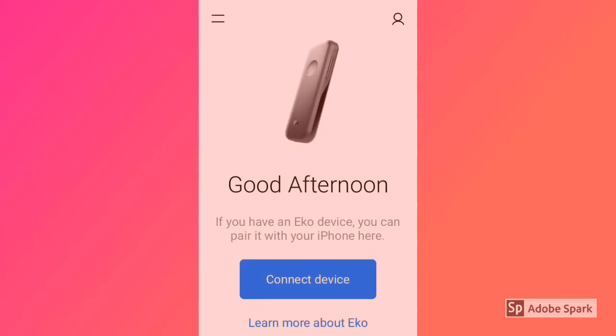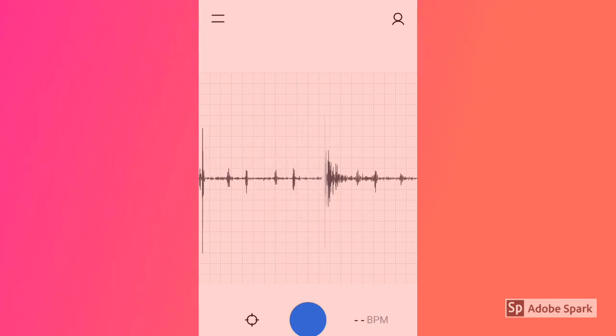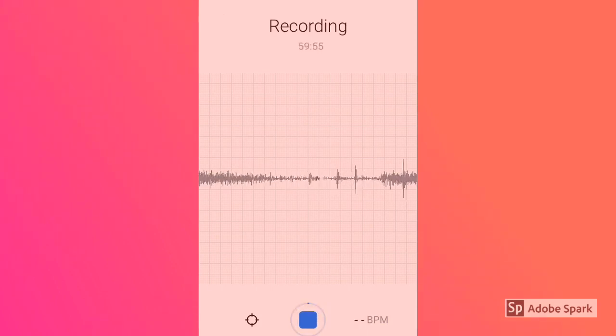Now don't forget we also have the echo app. Turn on your device and hit connect device, or it'll automatically pair. There's a little static as you first turn it on, but then — even though this isn't an EKG — it gives you a nice waveform so you can hear their heartbeat. Down in the bottom right it gives you a heart rate, and you can see breath patterns as well.